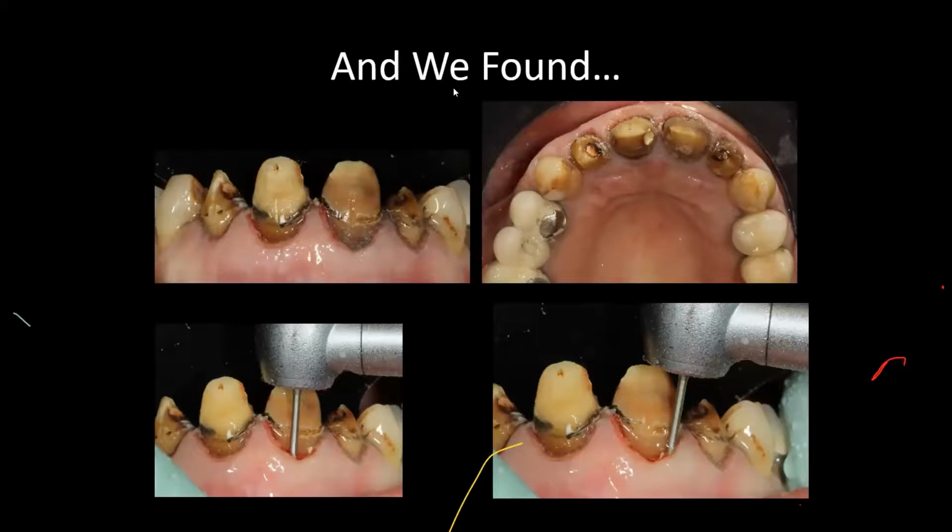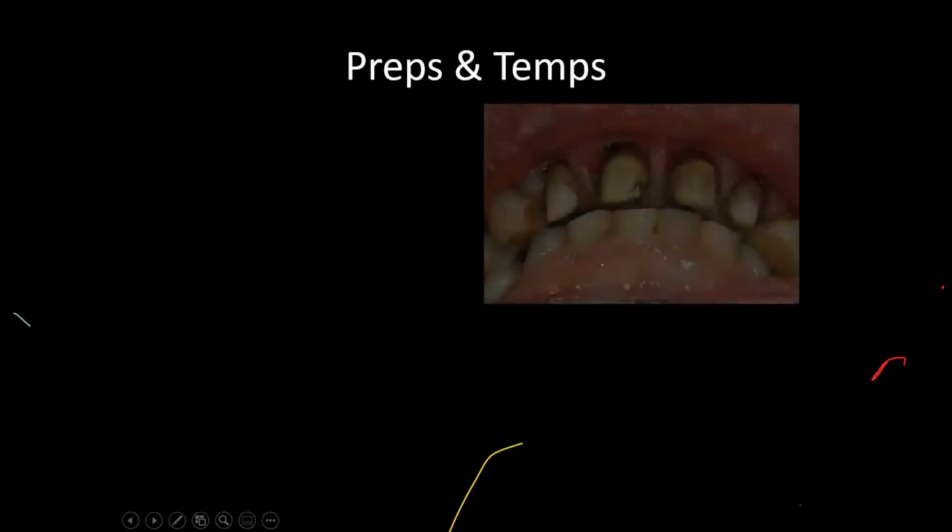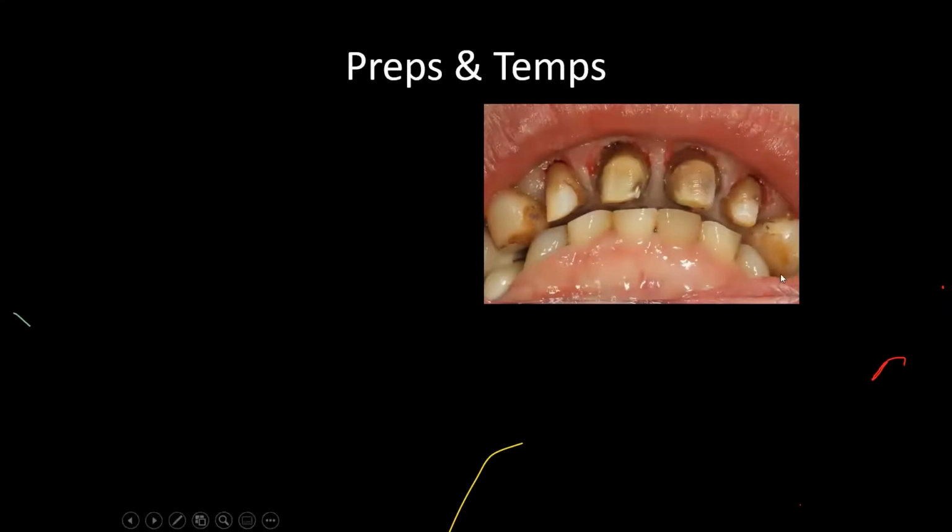Excellent. So then we go ahead and prepare his teeth to the level, because you can see that even in this particular situation, there's not a lot of bleeding. In many ways, I don't like the fact that people raise flaps to do a crown lengthening procedure. It can be done very simply, because otherwise you have to wait a good 6 months for that. But in this particular case, I can wait up to about 6 weeks and have my margins all stabilized. So here, you can see the amount of room that's available.